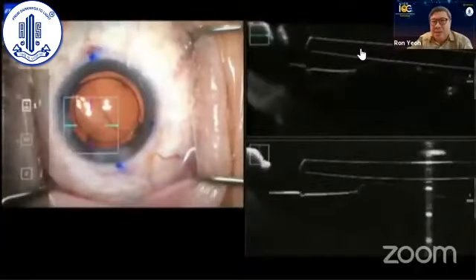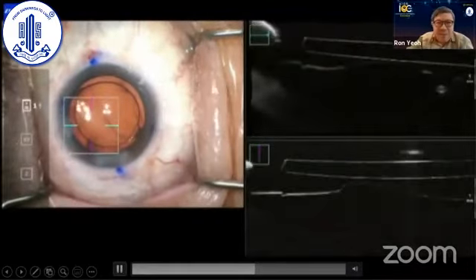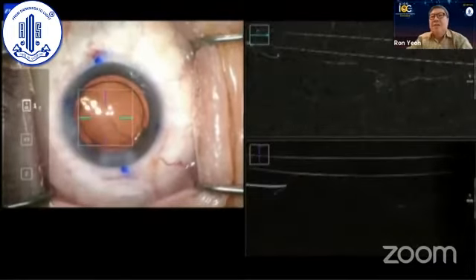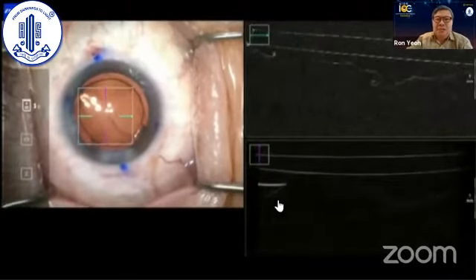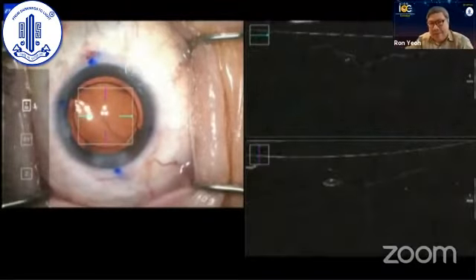So one use of the OCT is that the optic is behind the anterior capsular leaf that you see there. And then I'm going to bring the OCT over to that diagonal line behind the lens to see if we can see it. And here you can see the sign that I'm talking about. You can see that there's a scroll, that the posterior capsule, the edge of the PCR kind of curls up like a little scroll there.